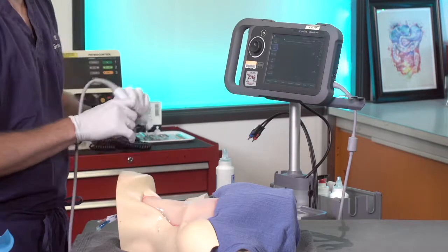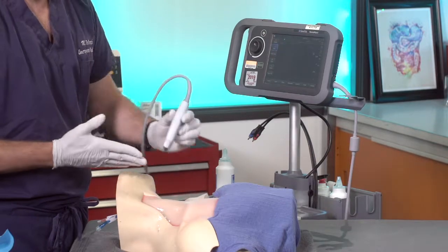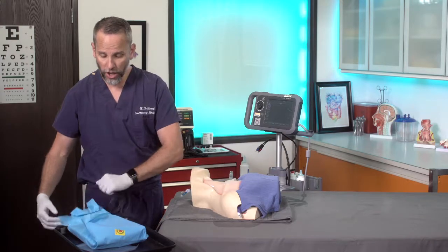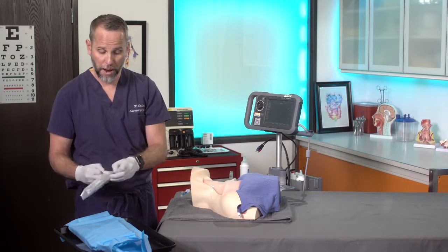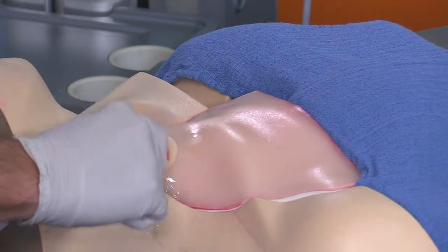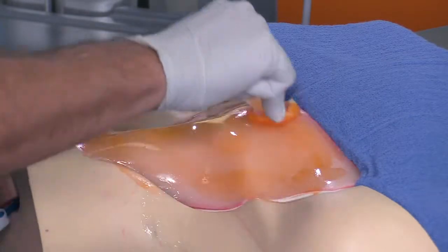When approaching this, it runs — if you're doing your landmarks — you'd be going toward the ipsilateral nipple. So I'm going to use this approach to get the line going in the direction I want. I'll put my probe aside and walk through what we have in this kit. This is a sterile kit — you're going to open it up. The first thing you're going to see is chlorhexidine so that you can prep the patient.